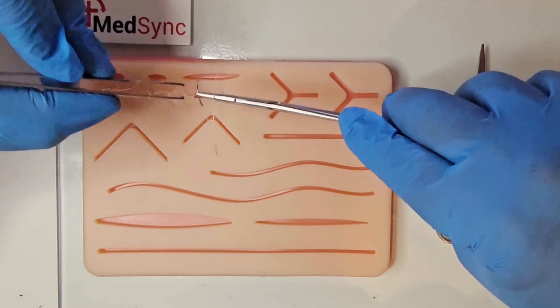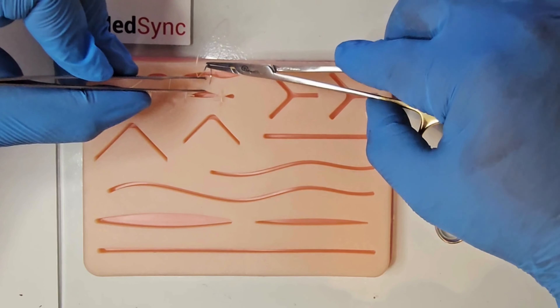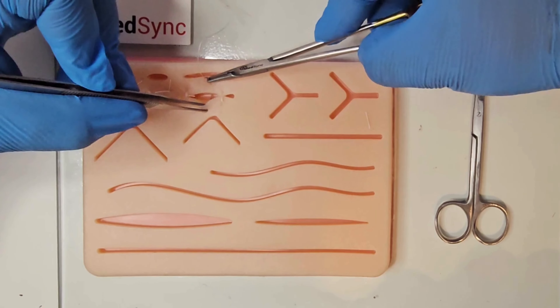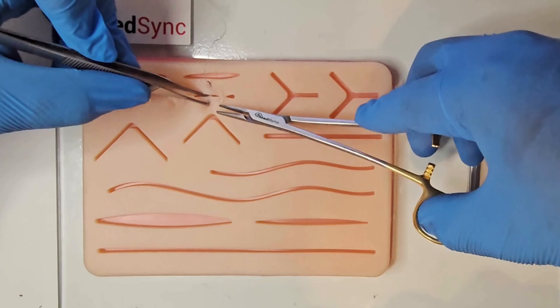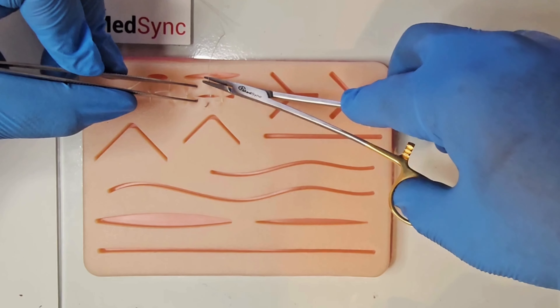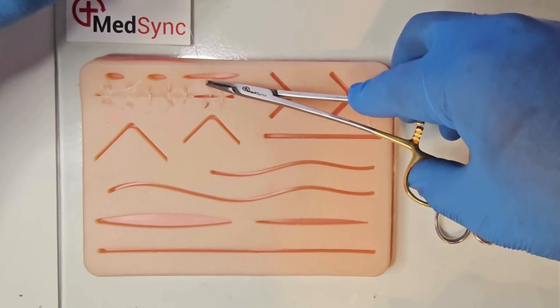Enter the skin at 90 degrees. You rotate your hand from palm down to palm up — a supination motion. For wounds that have opposed edges, you can cross to the other side in a single pass. Advance the needle by the body, not the point or you blunt it, and not by the swage or you fracture the thread off the needle.